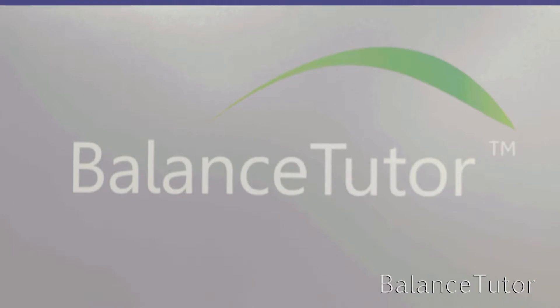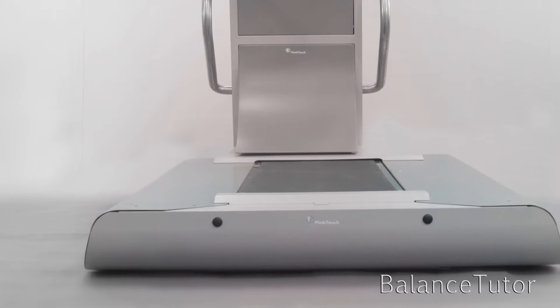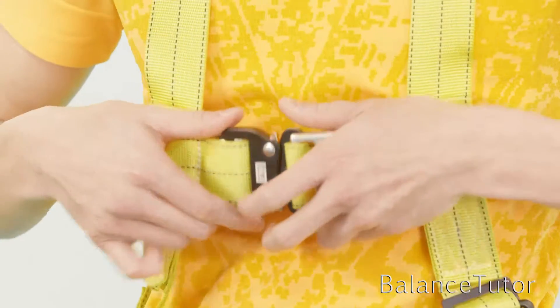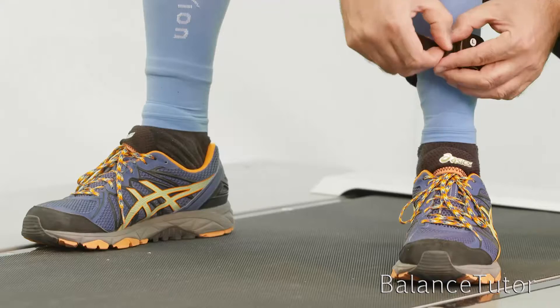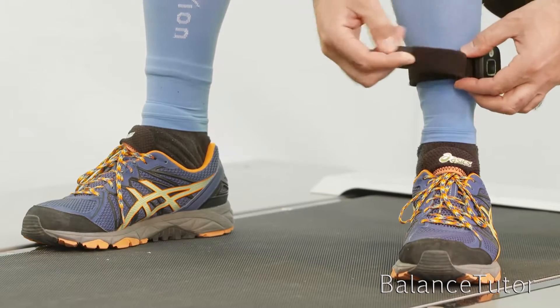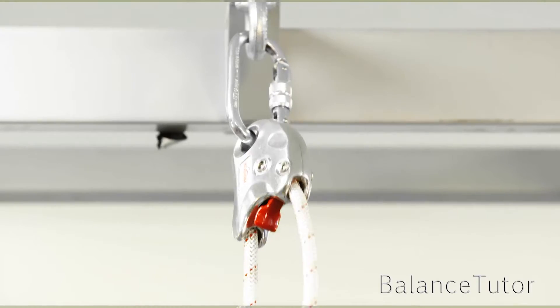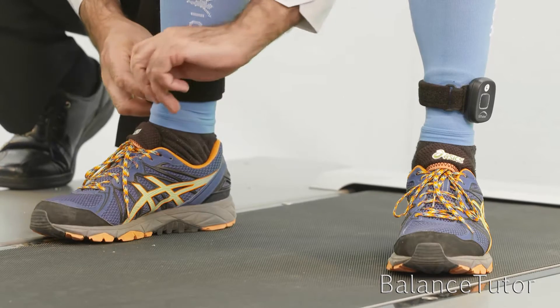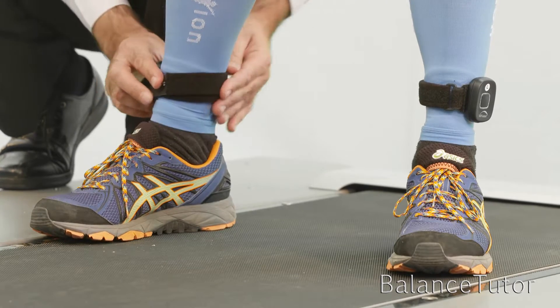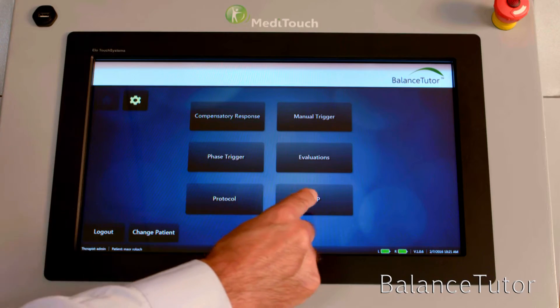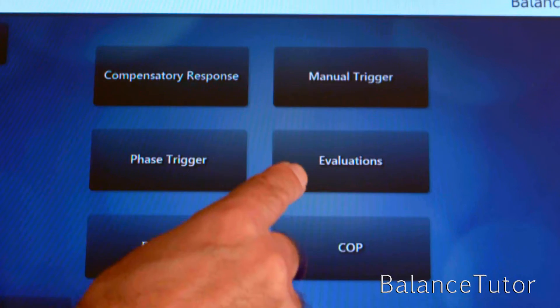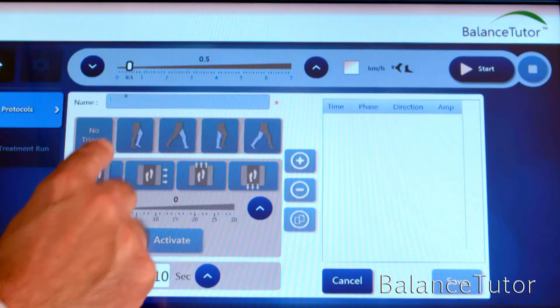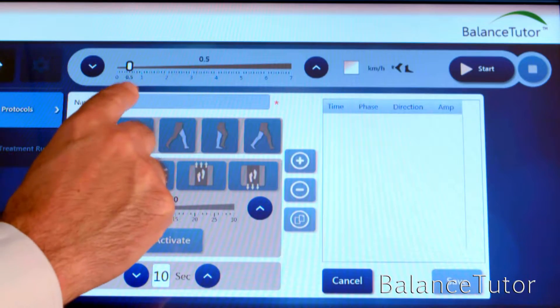Introducing the Balance Tutor Reactive Response Training System. The Balance Tutor is easy and fast to set up with a user-friendly program, fully customized protocols, reports, and documentation. The system features unique evaluations including a baseline and a return-to-play evaluation.